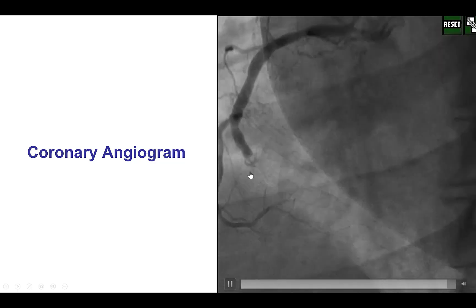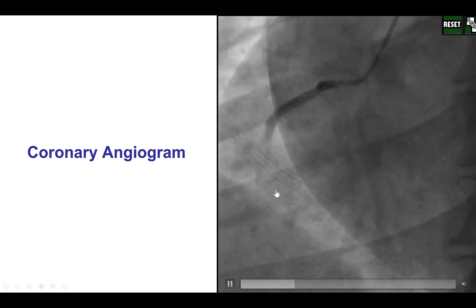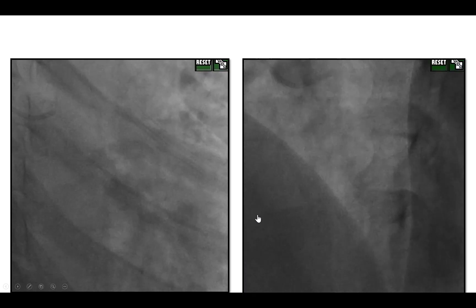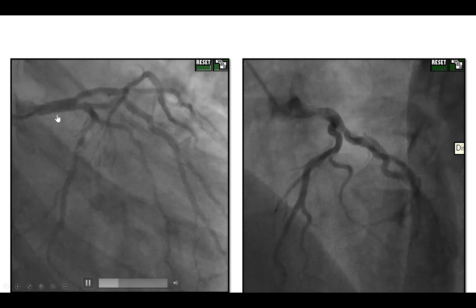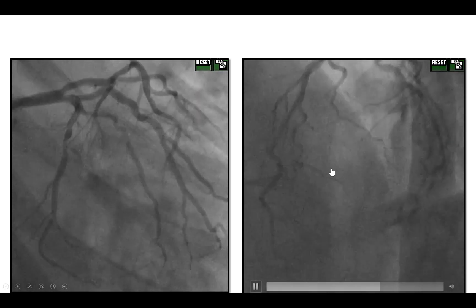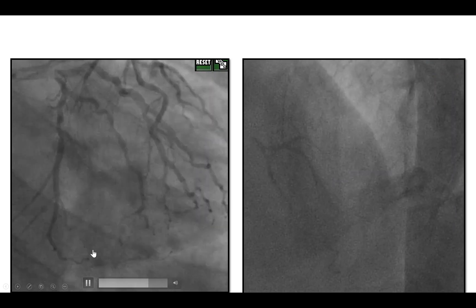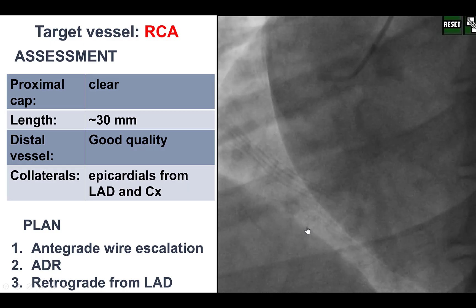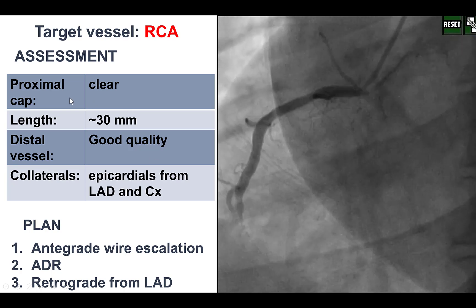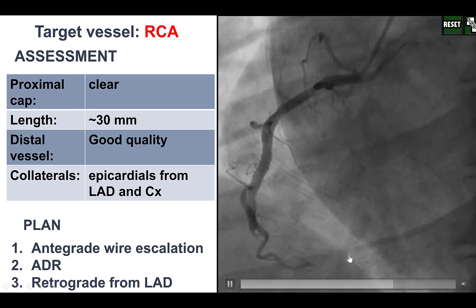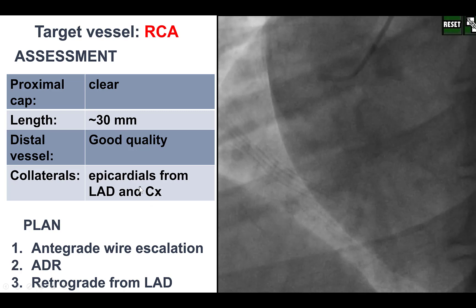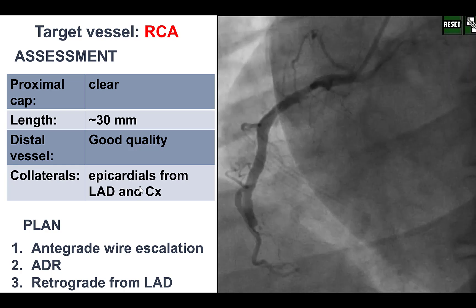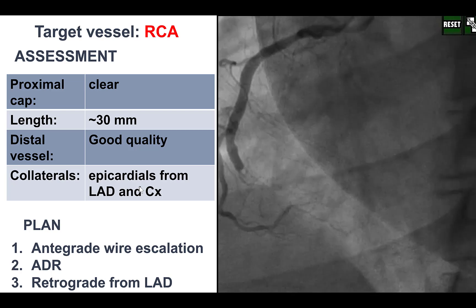This is the initial angiogram, demonstrating an occlusion of the distal right coronary artery. There was no significant disease in the left coronary system, which was providing mainly epicardial collaterals filling the right posterolateral and the right PDA. So what we have is a CTO of the right with a clear proximal cap, length of about 30 mm, good quality distal vessel, and mainly epicardial collaterals from the LAD and the circumflex. Although often in cases like this, there are also invisible septals that could potentially be crossed during retrograde attempts from the LAD.